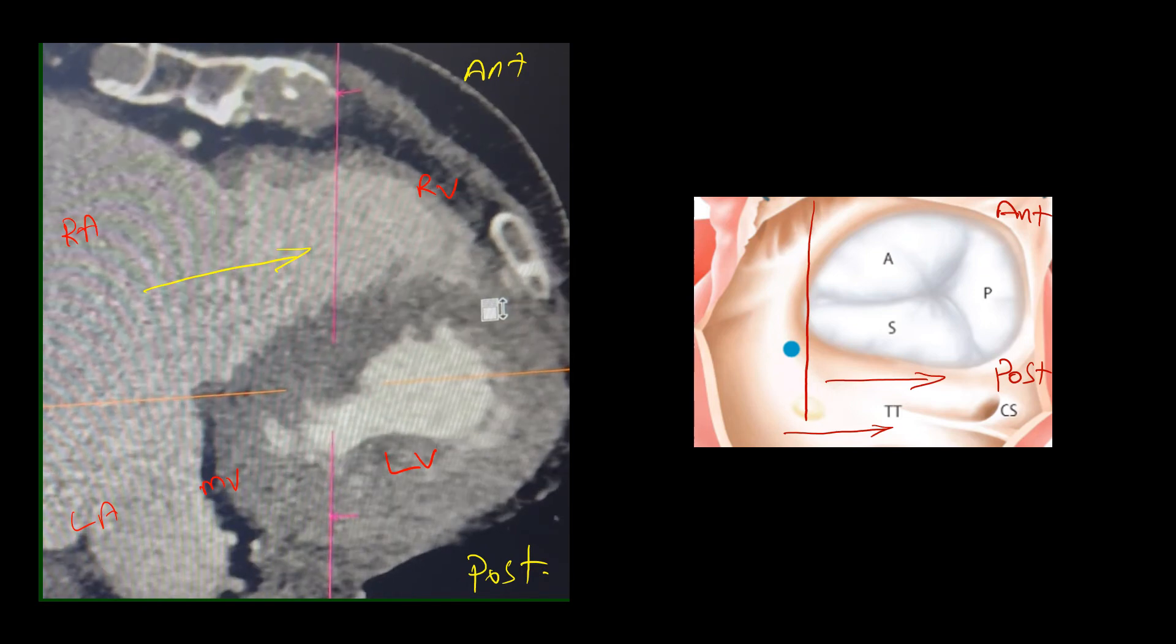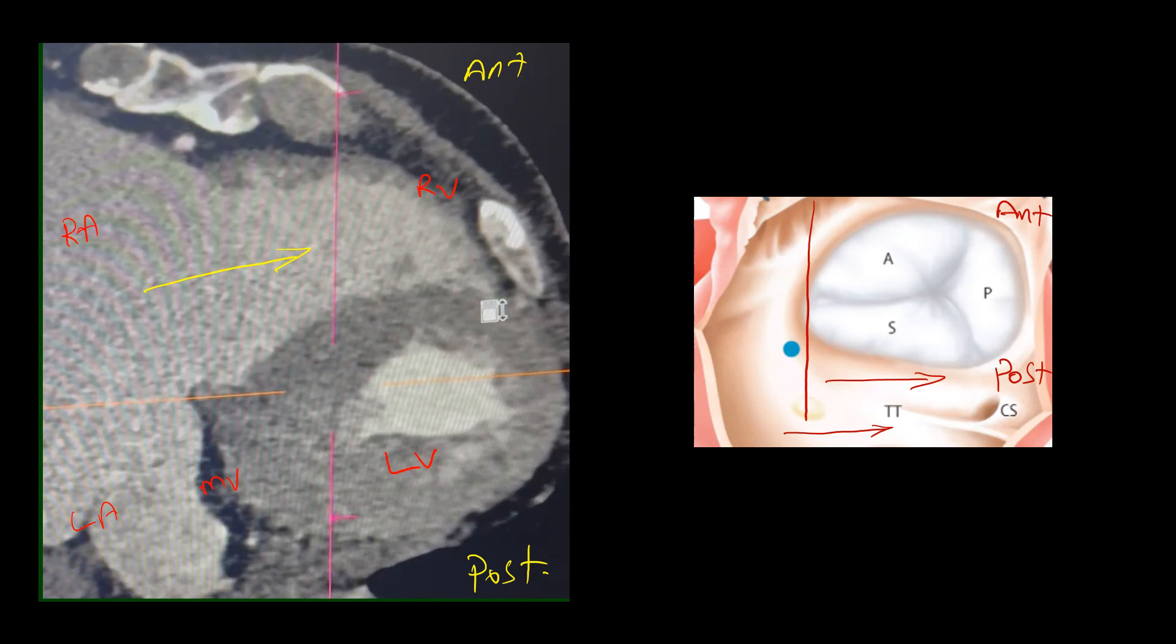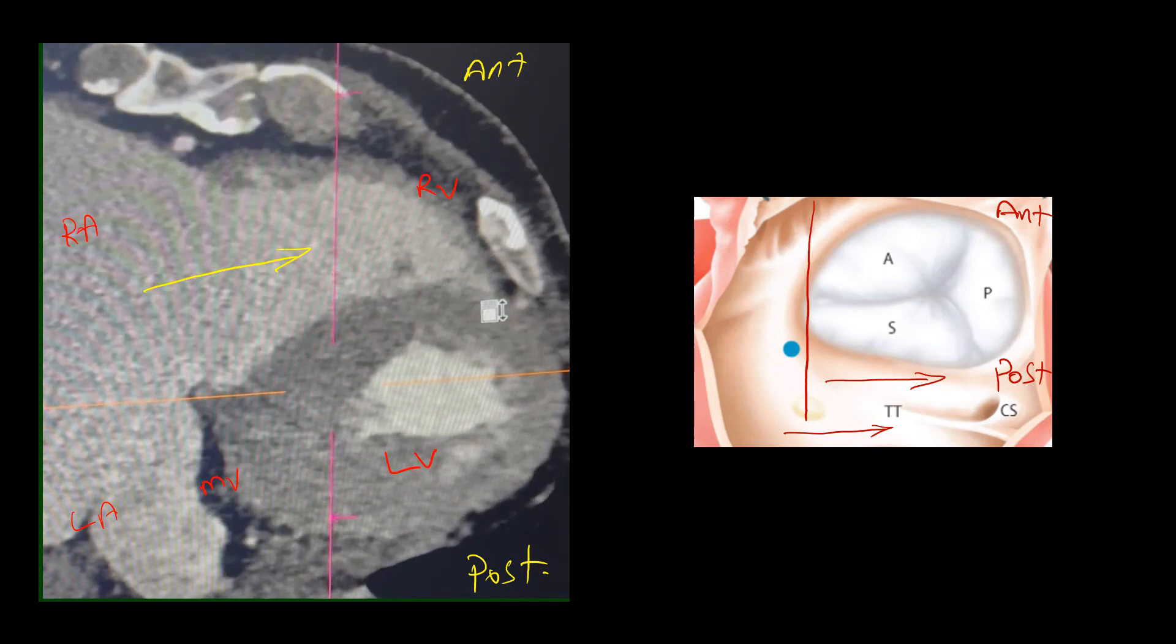The other important note in this view is a significantly dilated tricuspid annulus, which here measures about 55 mm, which is severely dilated.